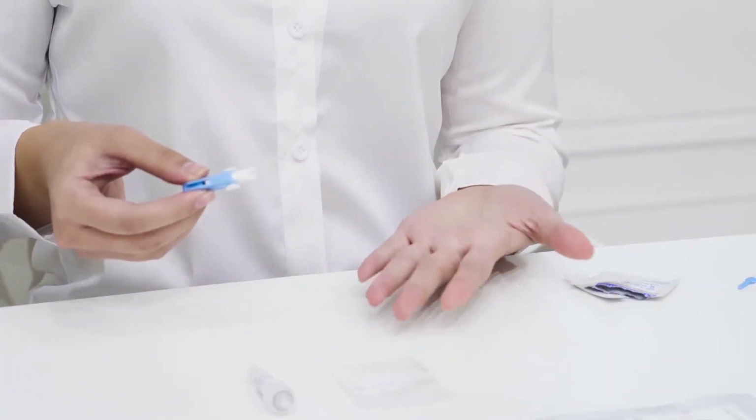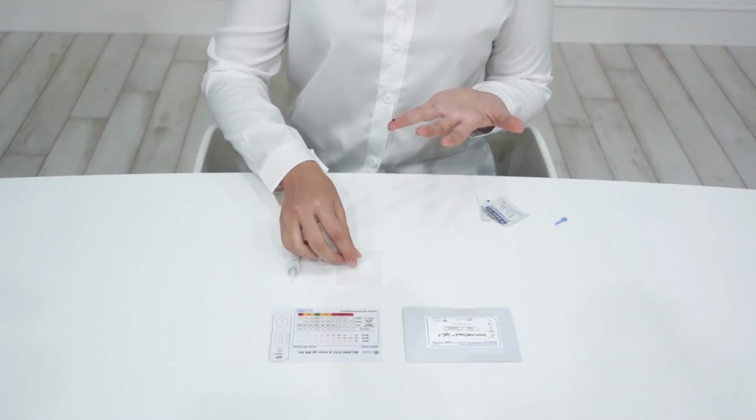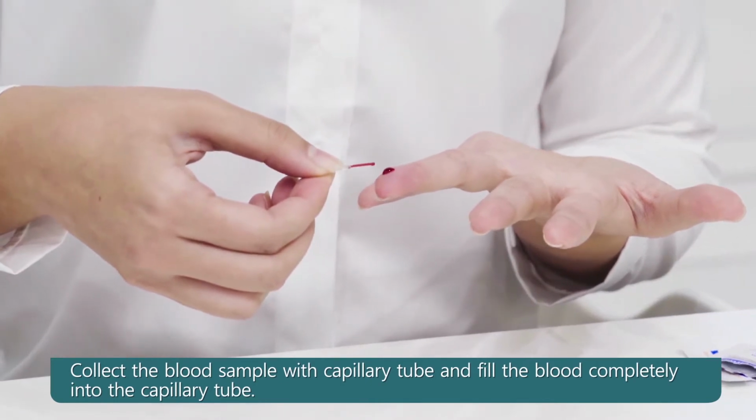Fourth step, position and press the lancet firmly against the puncture site on your fingertip. Fifth step, collect the blood sample with capillary tube and fill the blood completely into the capillary tube.